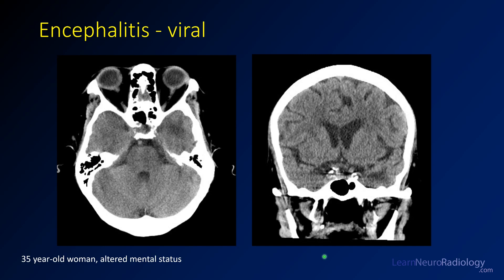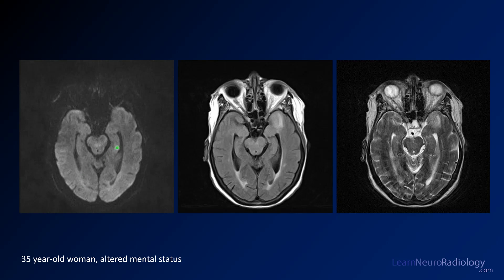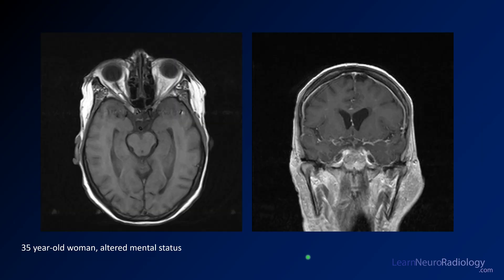This is a 35-year-old woman with altered mental status. CT shows subtle hypodensity in the left medial temporal lobe. On MRI, diffusion is relatively normal, but FLAIR and T2 show hyperintensity in the medial temporal lobe — a common location for encephalitis that should particularly suggest herpes. These patients need immediate treatment with acyclovir and antiviral medications. However, there is not much enhancement on post-contrast imaging here. This case ended up being VZV or EBV encephalitis — a viral encephalitis but not herpes.